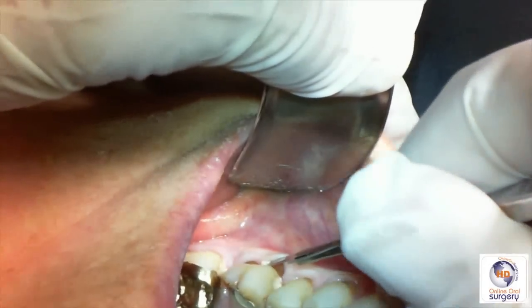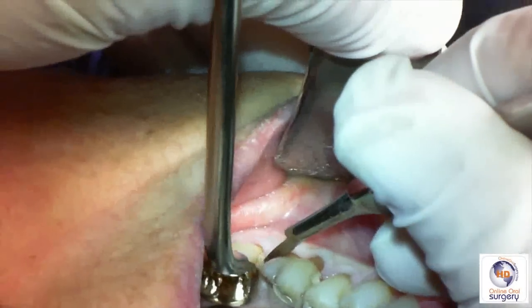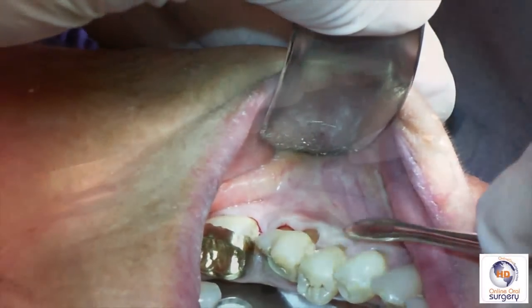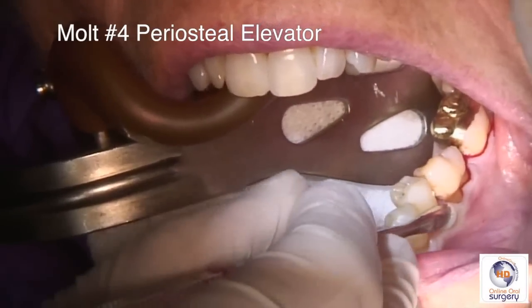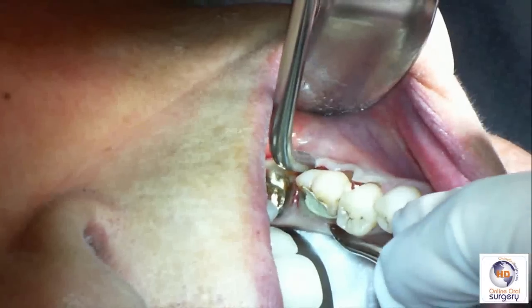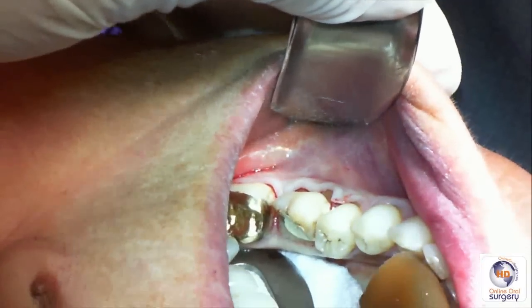We're going to start on the buccal and go about a half tooth on either side of tooth number 19, on the mesial and the distal. You want to take the blade all the way down to the bone so that we're lifting a clean mucoperiosteal full-thickness flap of the attached gingiva. We then use the pointed end of a Molt number four periosteal elevator to elevate our flap from the bone, making sure the tip goes all the way down to bone, and then do the same on the lingual aspect.